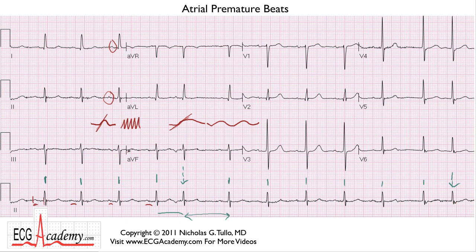If you look at the T wave from this beat, it's very smooth. And if you look at the T wave from this beat, you've got this sharp deflection at the very end of it that's clearly negative. And in fact, you can see it here in this lead as well. It's almost like the T wave here is a very broad, slowly changing signal that only goes positive, but here it goes in two directions.